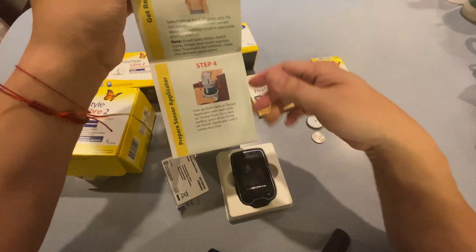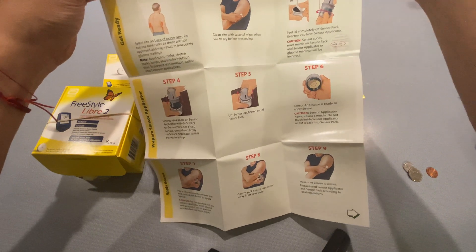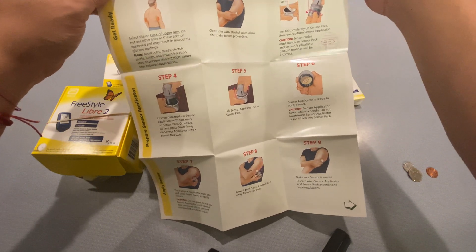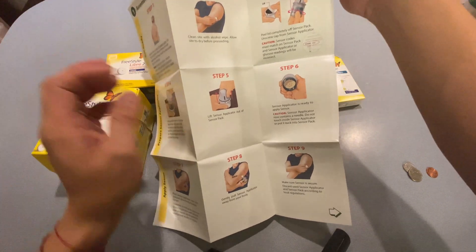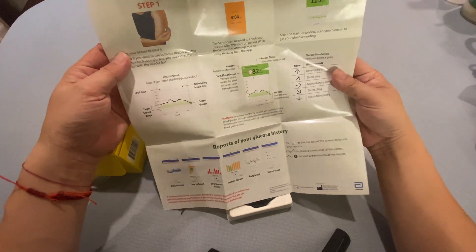If you just want to get started and you're tech savvy, there's a quick start guide: Step 1 through 9 tells you how to do it.